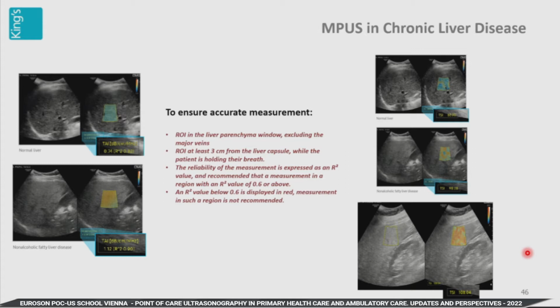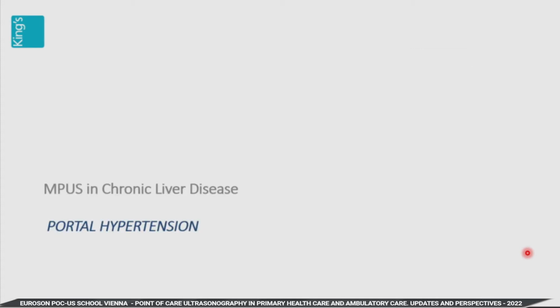But ultrasound machines, and this is particularly true of the Siemens machine, have a technique where there is a box with 15 measurements of your elastography and fat quantification, combining attenuation and backscatter to give you a fat percentage. And this will probably be the future of your point of care imaging of liver disease in the clinic, that you're able in 10 seconds to diagnose whether or not that patient is fibrotic and how much fat content is in that liver. So you have these tools coming through.